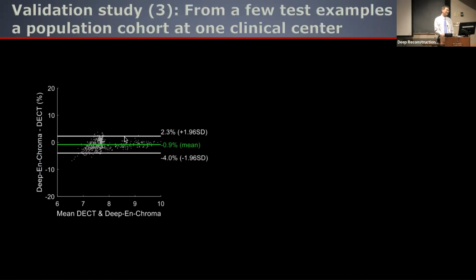All right, now let's really go through more; one case, two cases is not enough. Let's go through about 10 cases. So that is really the iodine basis image, and the rest is really the hardware-based result. We do the Bland-Altman analysis. You can see the bias is close to zero, and with this, the 95% limits of agreement are there. It's quite nice. Essentially all the data fall into this 95% confidence interval.